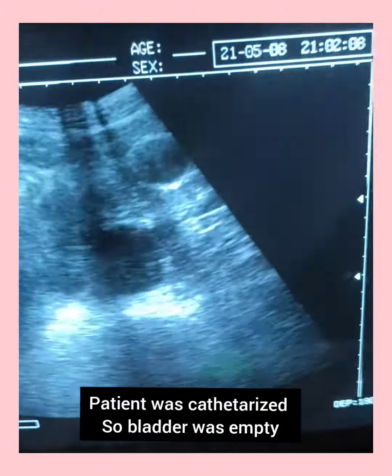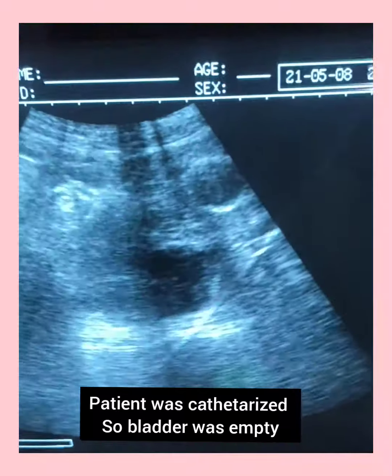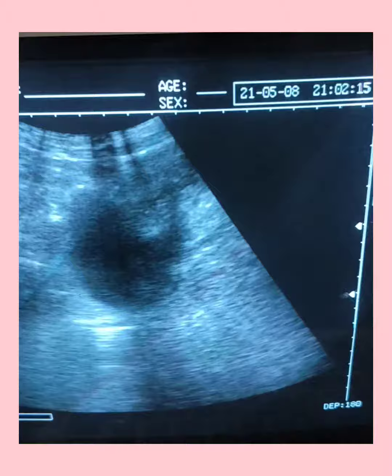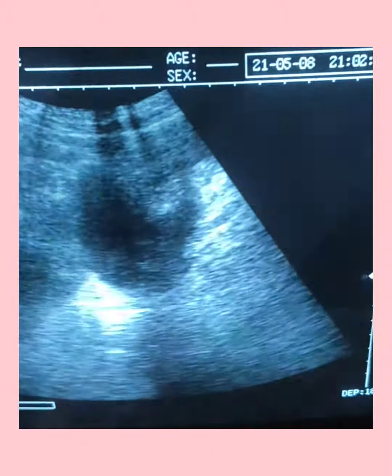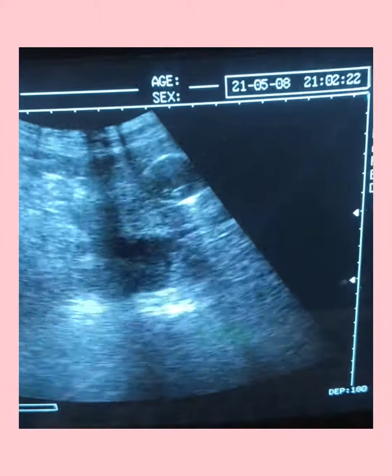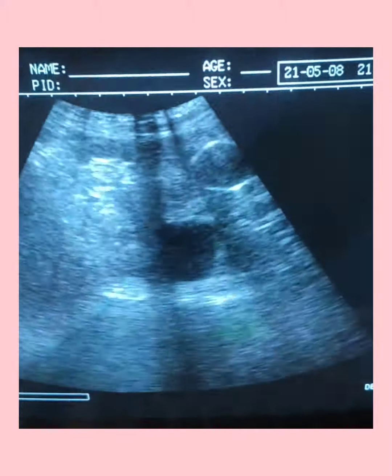This is a diverticulum of the urinary bladder, located posteriorly. Anteriorly, the balloon of the Foley's catheter is visible. There is a communication between the bladder and the diverticulum. The bladder is not filled with urine, while the diverticulum is filled with urine.